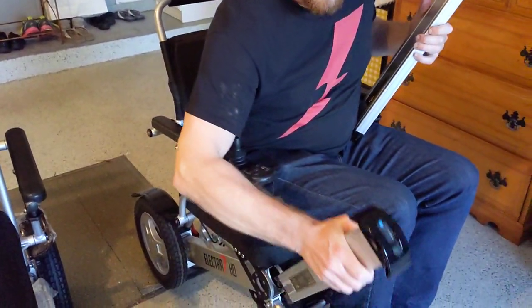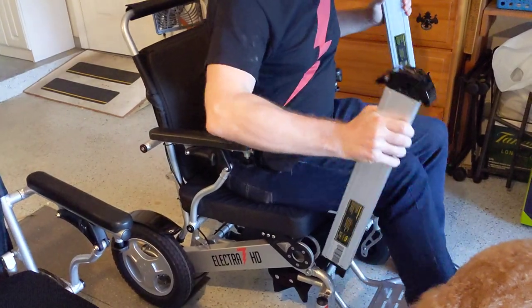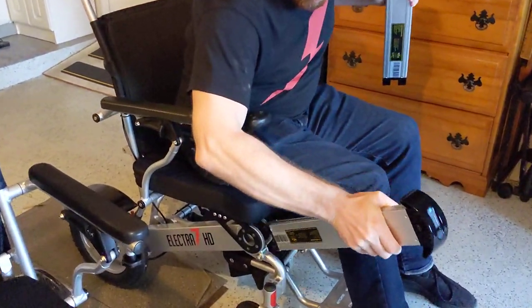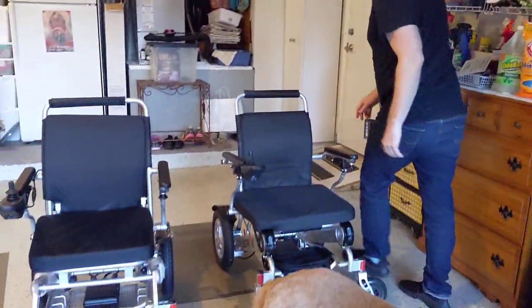I'm actually going to sit in the Electro 7 — go ahead and get your stopwatch out. Okay, there's one battery in, and there's the other battery in. Okay, so both of those are done.